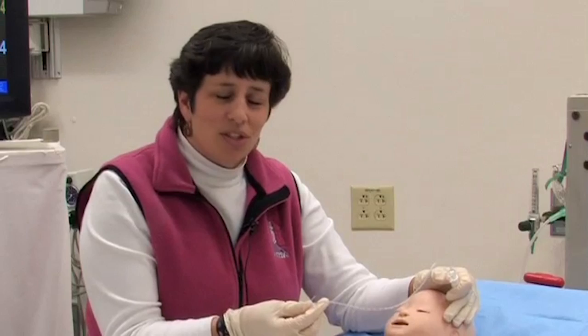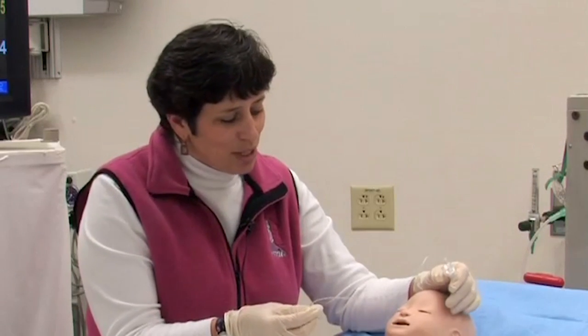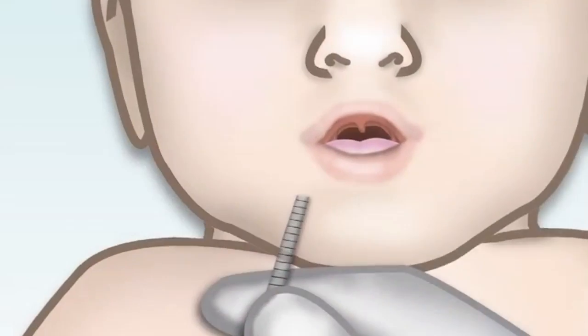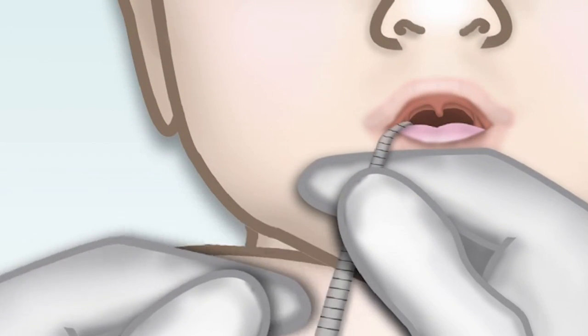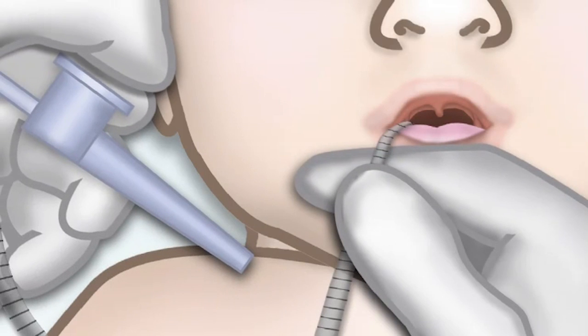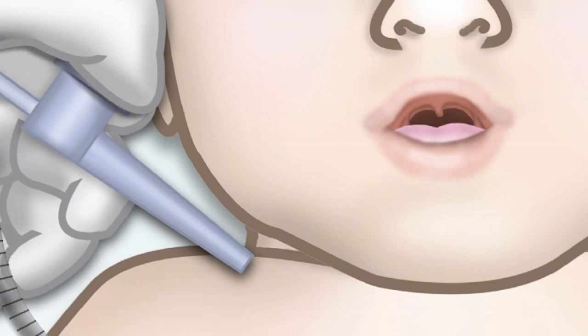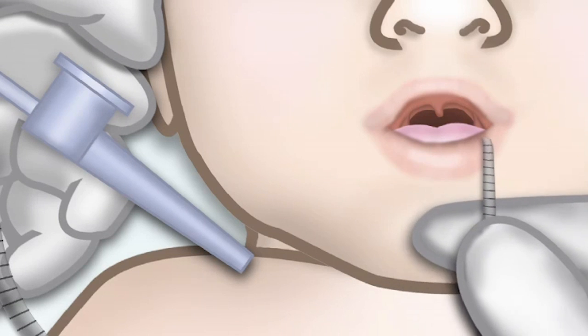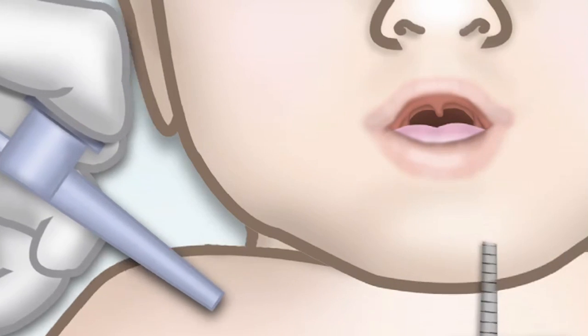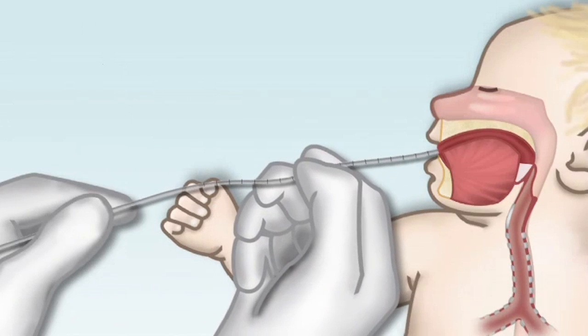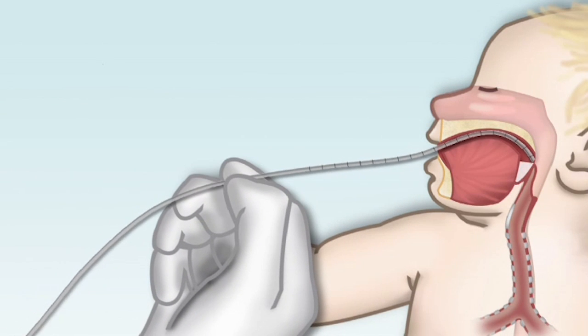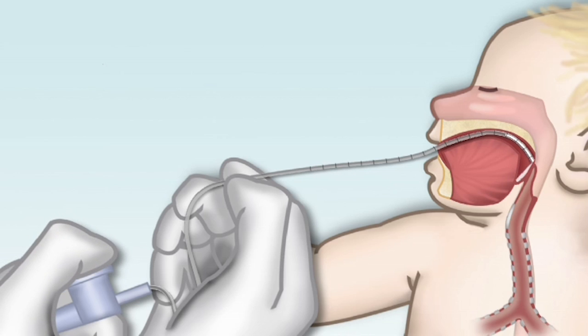For oral suction, if the patient is non-cooperative, you may just need to gently guide their head. Apply the suction into the side of the mouth, then go around to the other side. Try to get under the tongue and over the tongue to remove any pooled secretions in the back of the throat. Take care with a patient who has a strong gag reflex or has just been fed, as you don't want them to gag and vomit feeds still in the stomach.